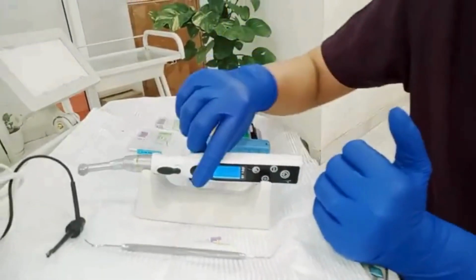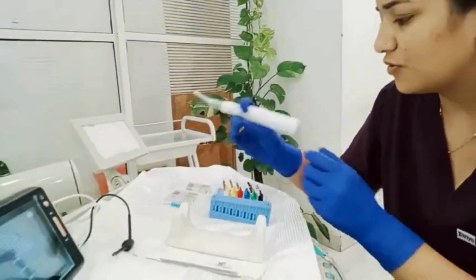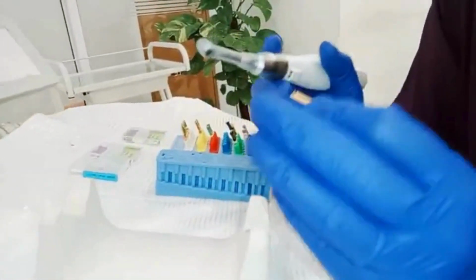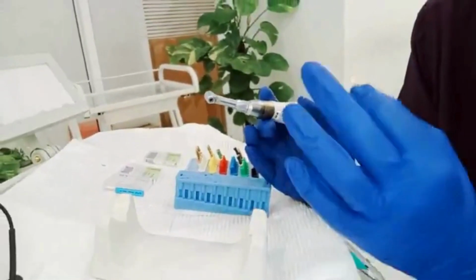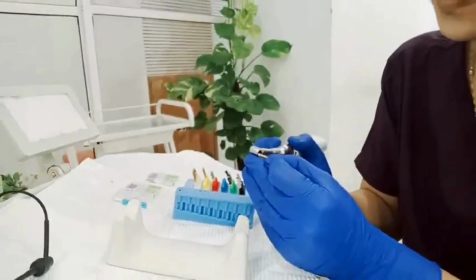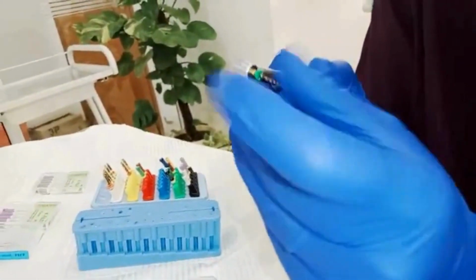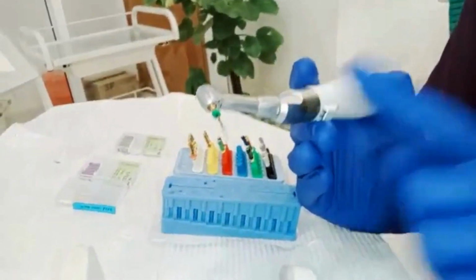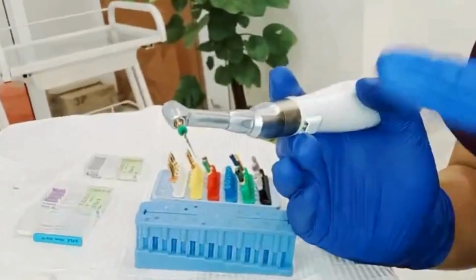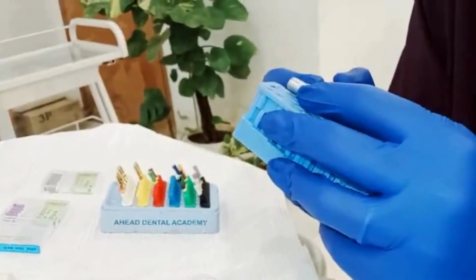Then after that you will be using your endomotor. I have opened it now. So firstly, after negotiating it with 10K file, till the time we have not used any apex locator for working length, so now I have used orifice opener firstly. After I have used 10K file, then I'll be using orifice opener here. So this is the orifice opener. I'll mark it till 15 mm.